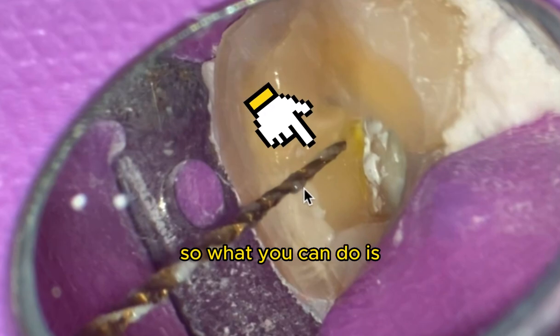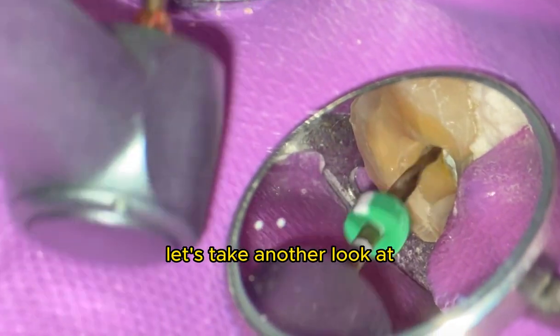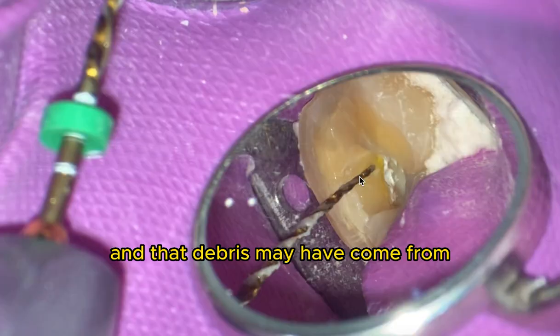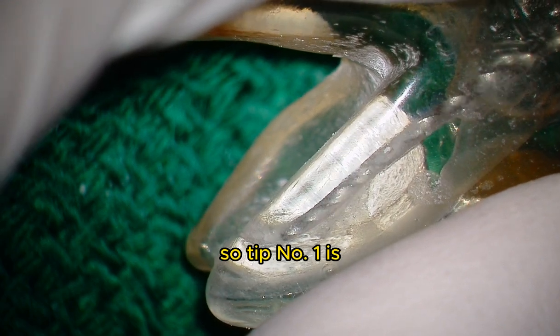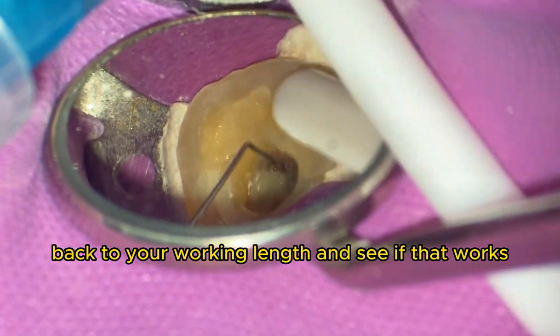You can run your file back a few times and shape a little bit more. That debris may have come from just inadequate shaping, or it may have come from debris falling when you were irrigating. So tip number one is to go ahead and run your file back to your working length and see if that works.